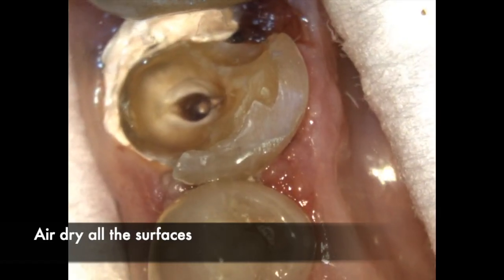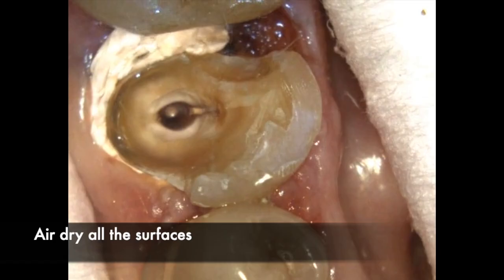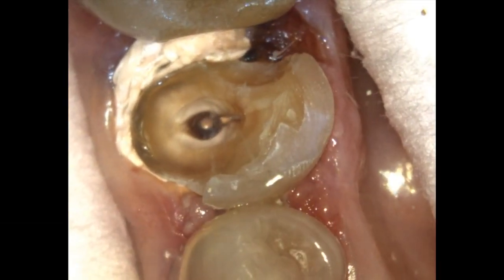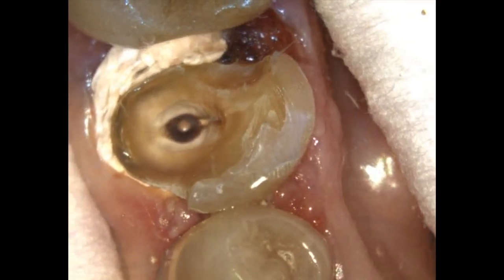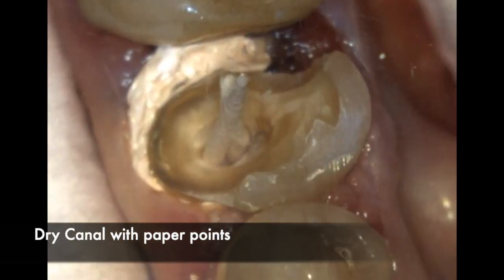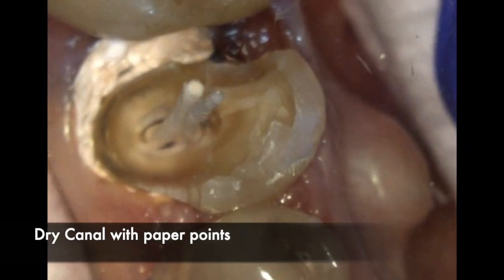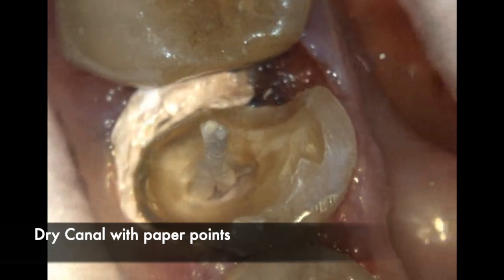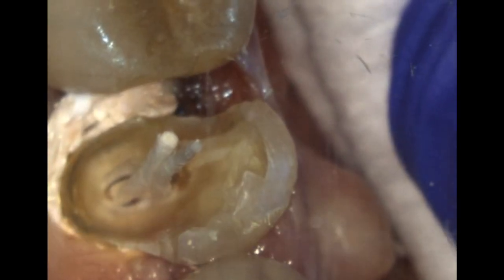Once all the surfaces are air dried, ensure isolation is being maintained — there is no bleeding in the area and no crevicular fluids coming out of the sulcus. Then use paper points to dry the canal and make sure the canals are completely dry before you start the bonding process for the post and the buildup.